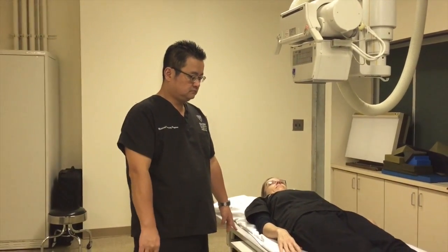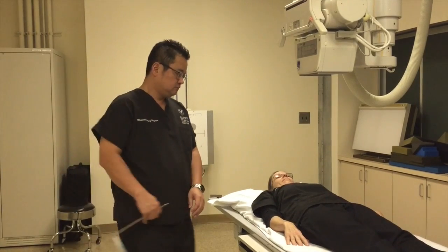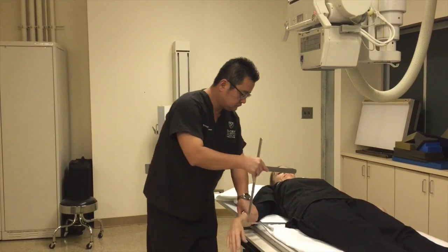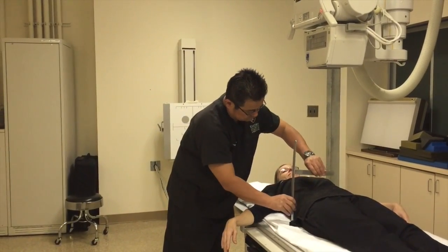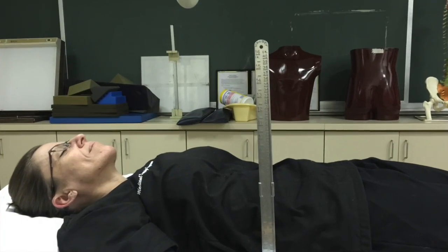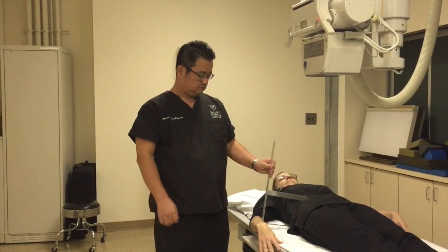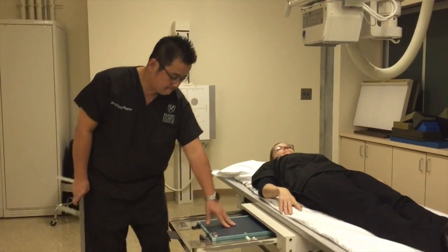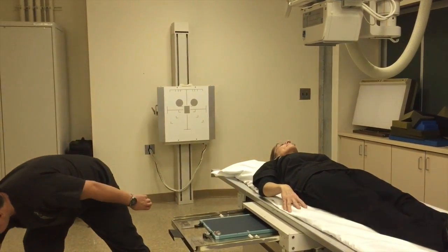Immediately after contrast administration, the tech will set up for a nephrotomogram, which consists of three projections at different fulcrum levels. The tech will measure the patient halfway between the xiphoid tip and iliac crest to determine the three fulcrum positions. The tech will place a 10 by 12 IR crosswise with the right marker at the bottom of the cassette and a number indicating the fulcrum level at the bottom middle of the cassette.